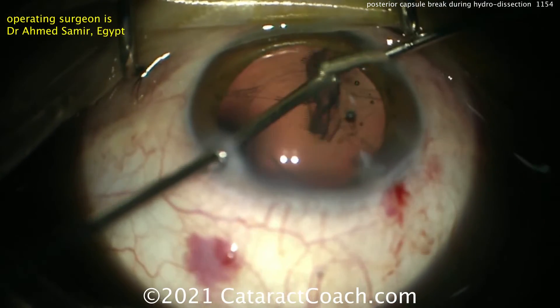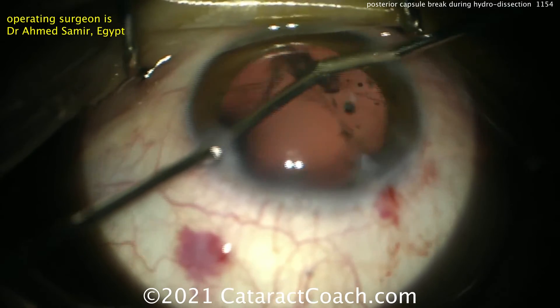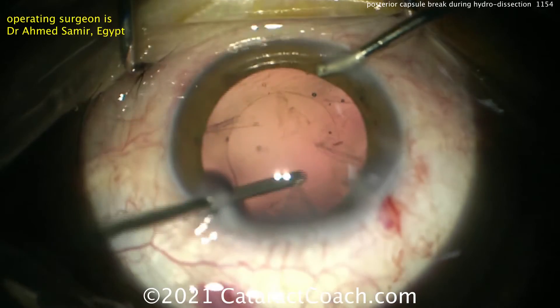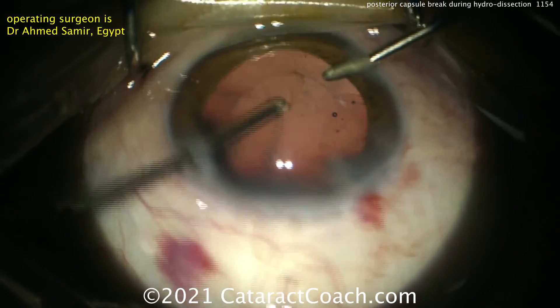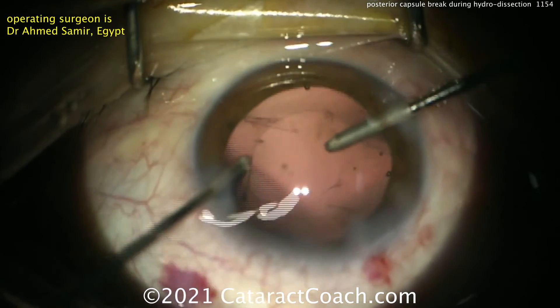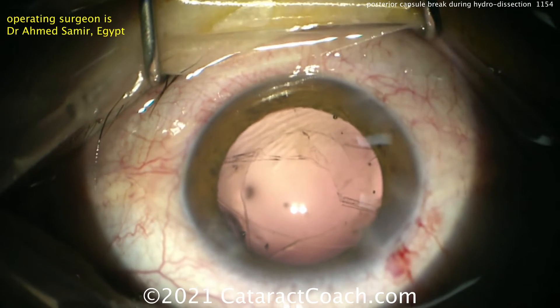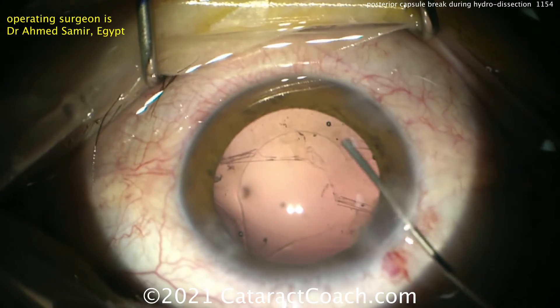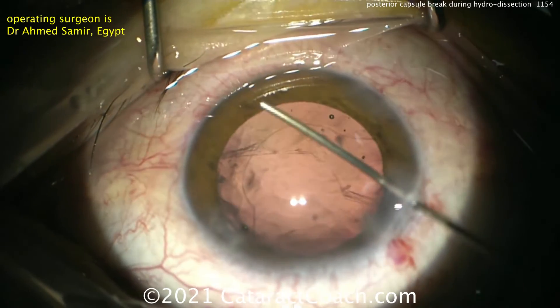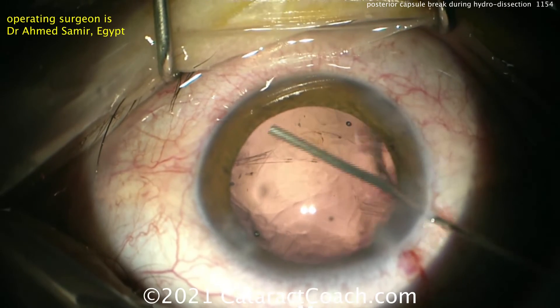Dr. Samir had a beautiful save here. For my preference and comfort zone, I have many great vitreoretinal colleagues in Los Angeles, so if this happens I would prefer to let the nucleus keep falling back into the vitreous cavity, then clean up the anterior segment. You can send the patient to your retinal colleague either aphakic, or if you clean up the anterior segment well you can put in a sulcus lens with optic capture.